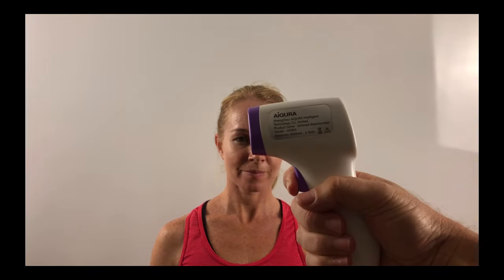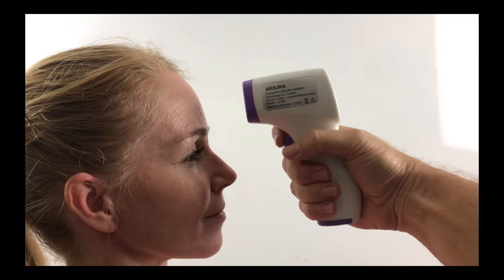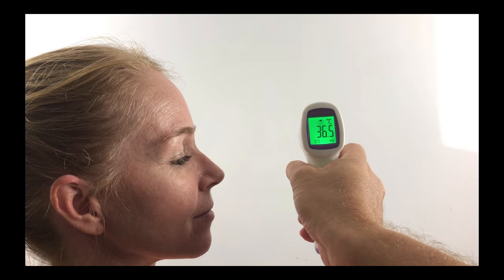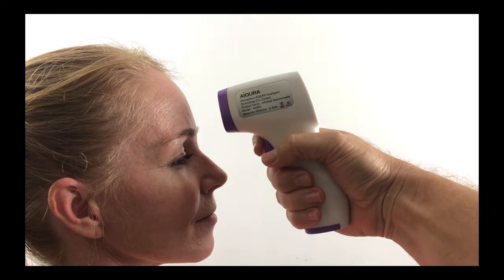Activate the device by depressing the trigger for five seconds. When taking a temperature sample, lightly depress the trigger, holding the gun in a stable position three to five centimeters away from the candidate's head.